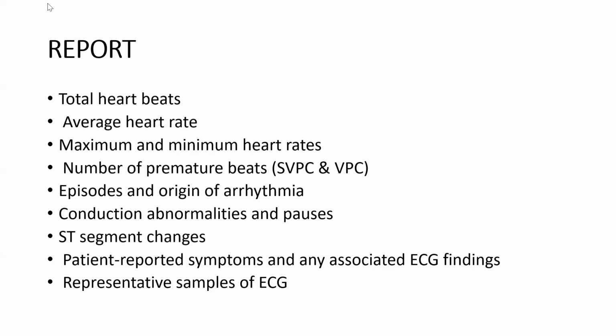So we expect to find the total heartbeat, the average heart rate, minimum and maximum heart rate, and the number of premature beats in number and percentage as well.